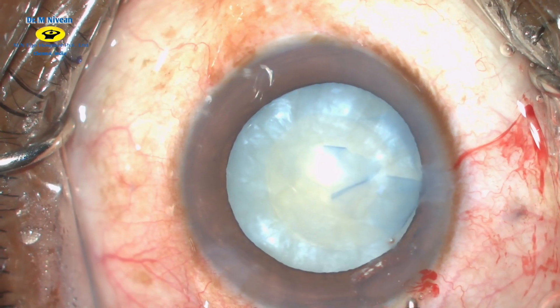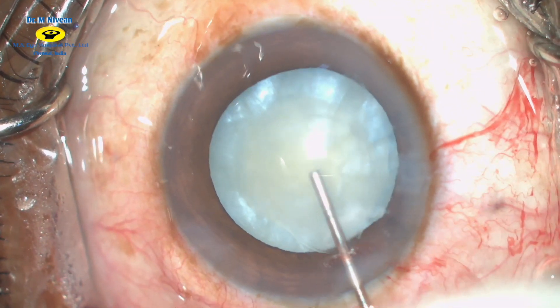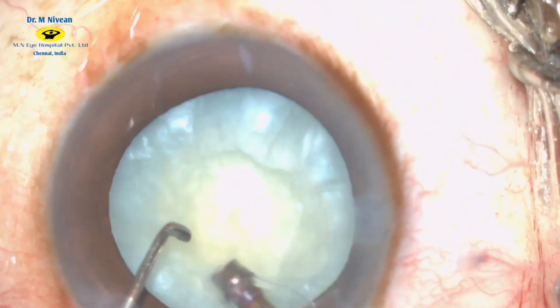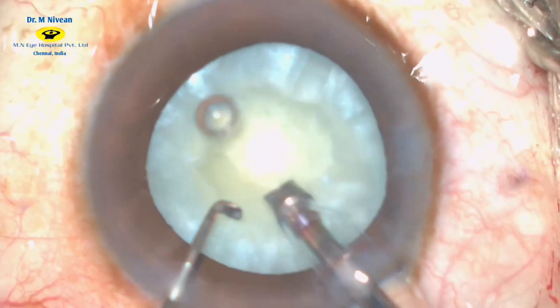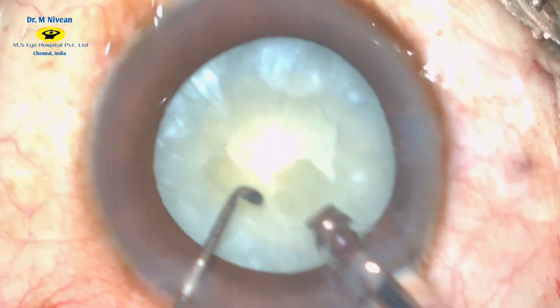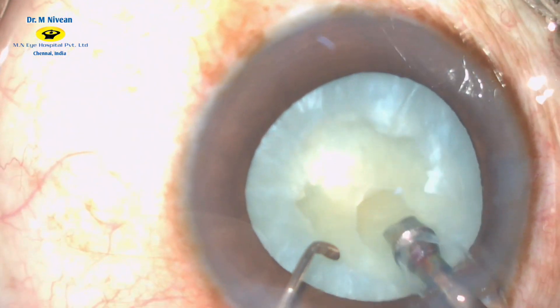A gentle hydrodissection is done and the nucleus is tapped at the center so that the fluid trapped beneath it escapes. With only aspiration, the loose cortex is aspirated first. A small trench is then made at the superior quadrant of the nucleus, like a burr hole.